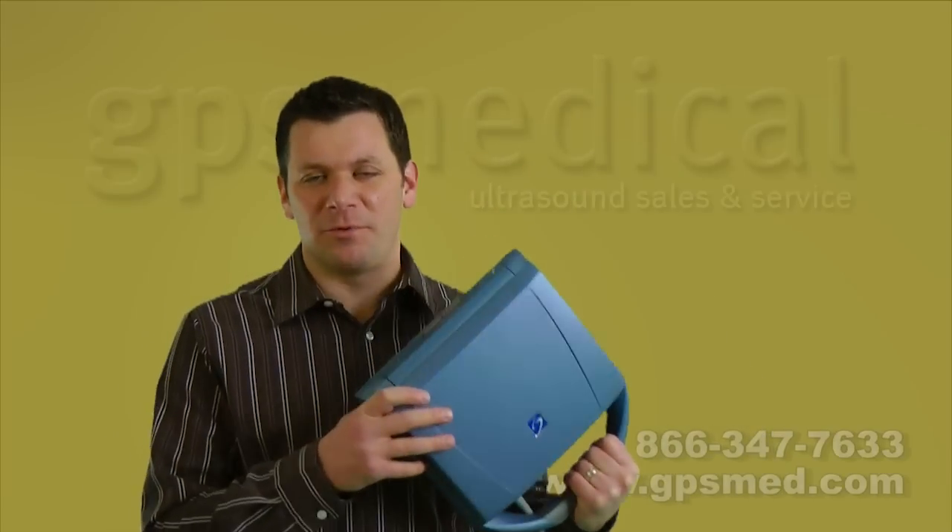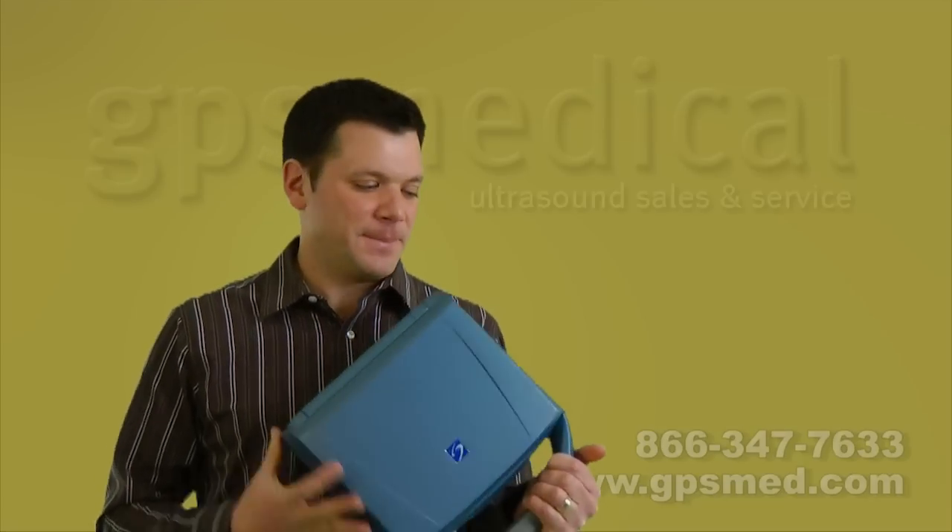For what it is — for the price, the durability, the image quality — for certain markets, it really is an excellent answer. For other markets, it's a terrible answer. And I'll show you why.